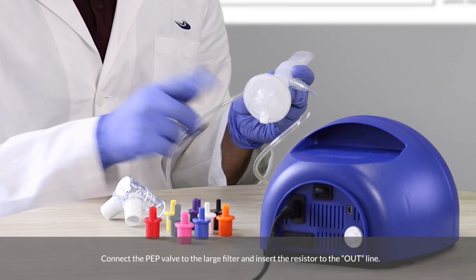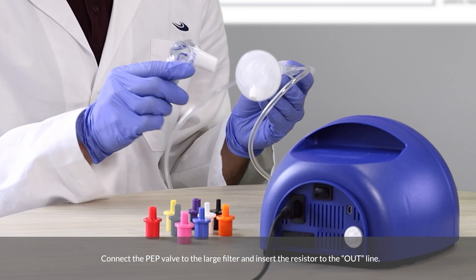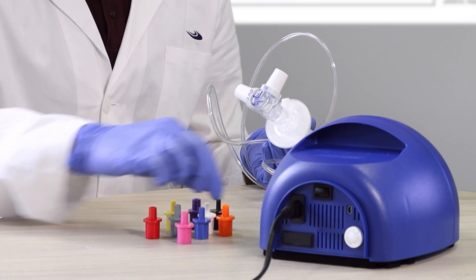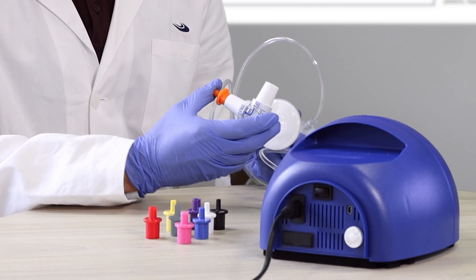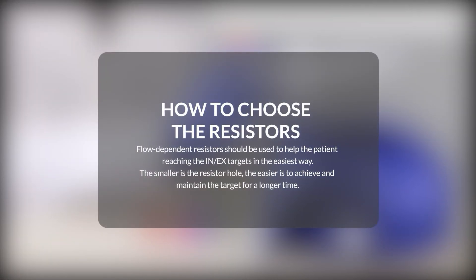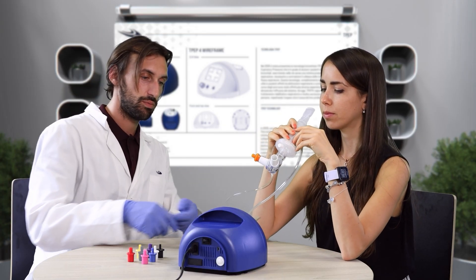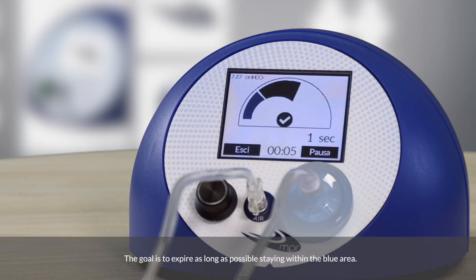Connect the PEP valve to the large filter and insert the resistor to the out line. Flow-dependent resistors should be used to help the patient reach the inspiratory-expiratory targets in the easiest way. The smaller the resistor hole, the easier it is to achieve and maintain the target for a longer time. The goal is to expire as long as possible, staying within the blue area.